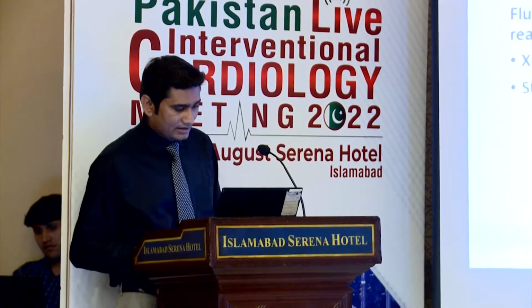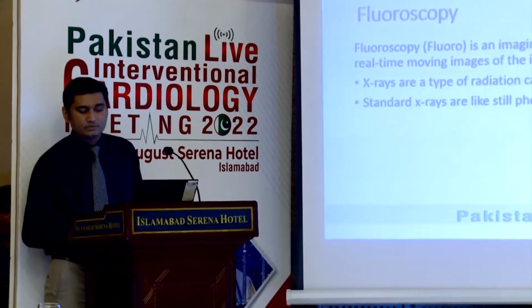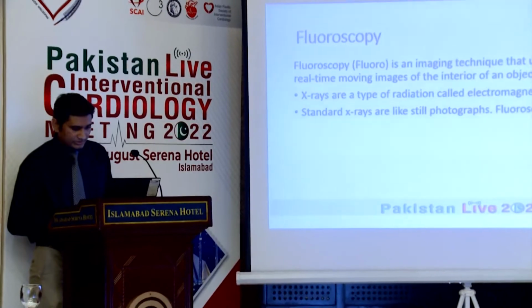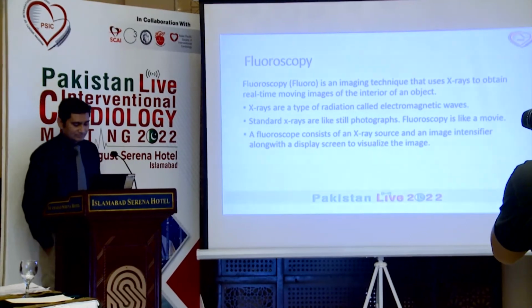So fluoroscopy is an imaging technique that uses X-rays to obtain real-time moving images of the interior of an object. X-rays are a type of radiation called electromagnetic waves, and standard X-rays are like still photographs, and fluoroscopy is like a movie. So this is the basic difference between X-ray and fluoroscopy.